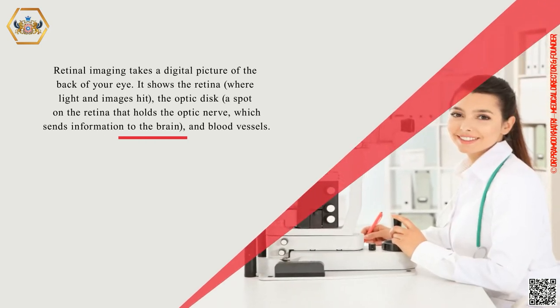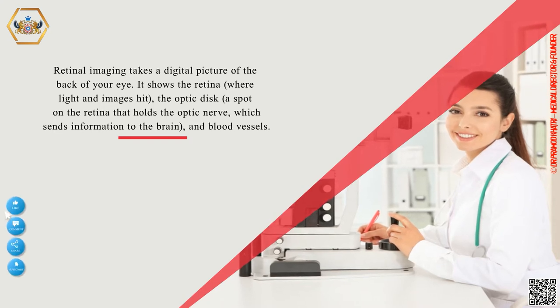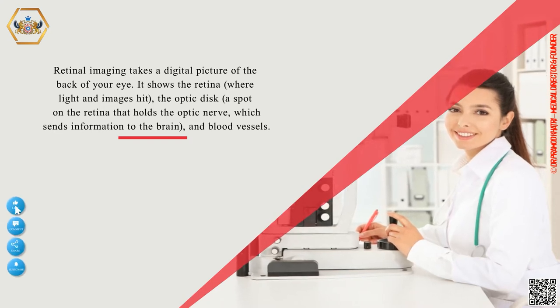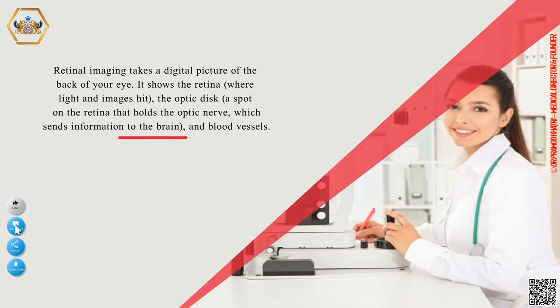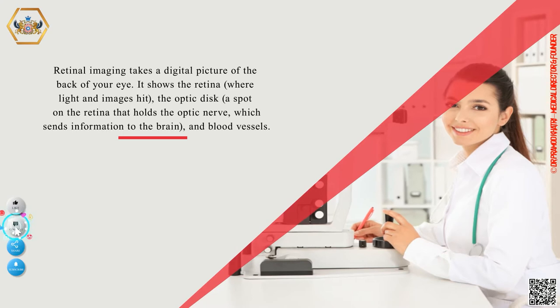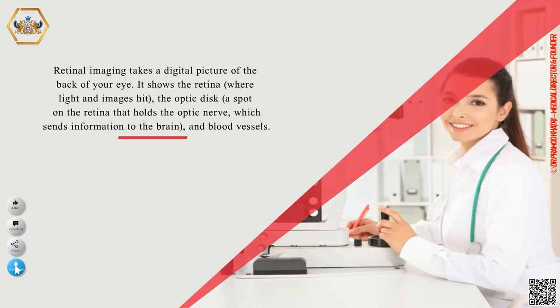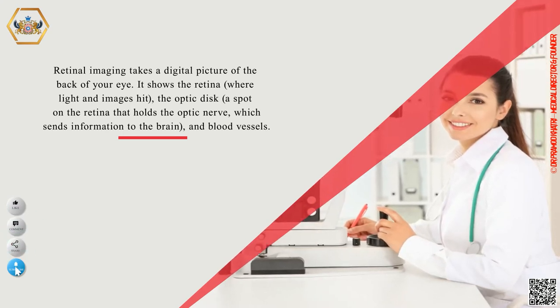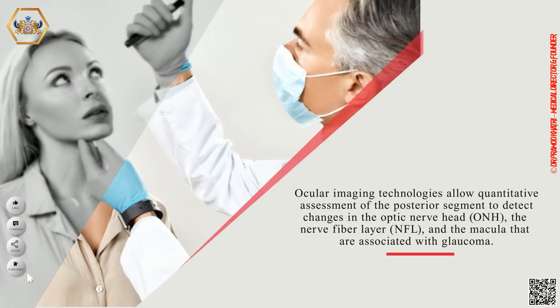It shows the retina, where light and images hit, the optic disc — a spot on the retina that holds the optic nerve, which sends information to the brain — and blood vessels.